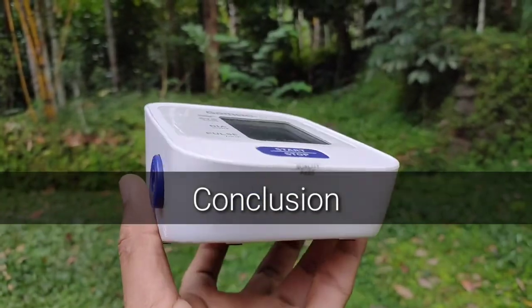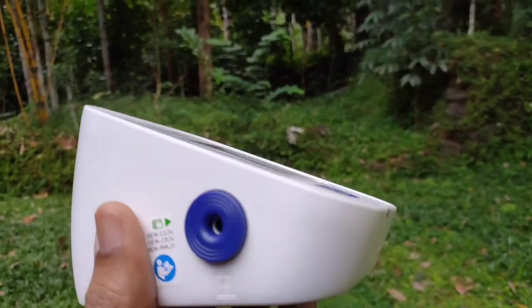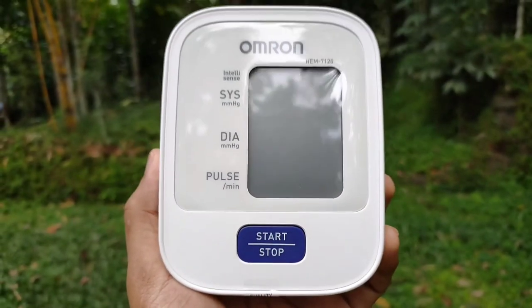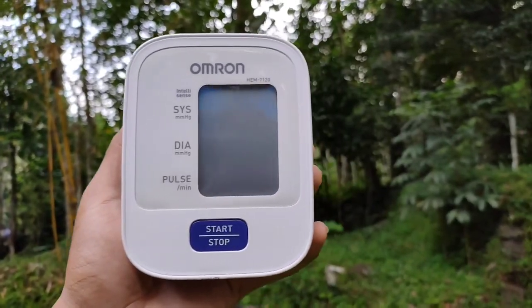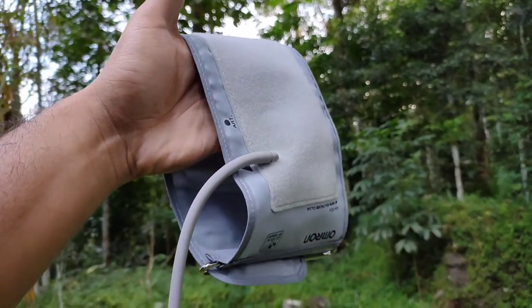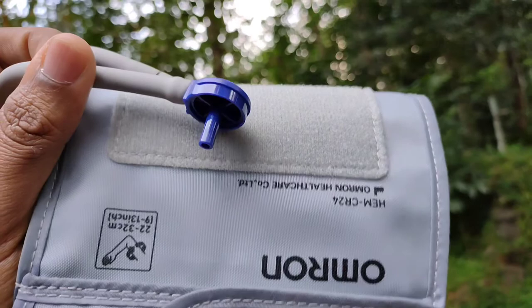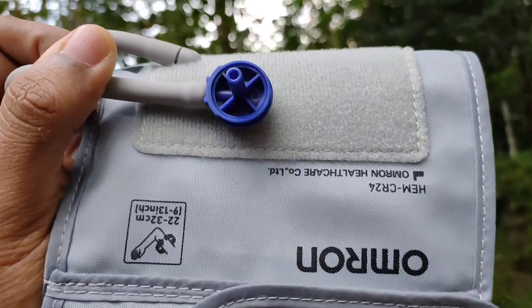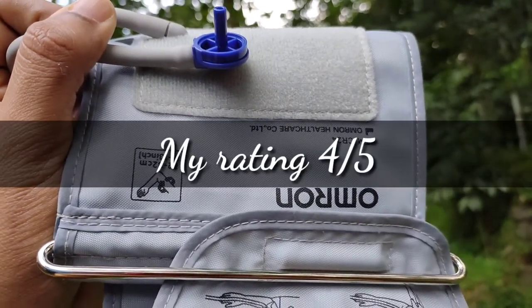I bought this blood pressure monitor for my parents and it was priced at Rs 1800. It's definitely a good product in this price segment and the values are more reliable than any smartwatch in the same price range. Build quality and construction are really good, though I felt it would have been great if Omron had provided a carry case or pouch. The arm cuff is of latex-free construction, made of nylon, polyester, and PVC — it feels good and the texture is just right. One concern: when I ordered from Amazon, 5 years of warranty was mentioned in the product description, but now they have changed it to 3 years, so I do doubt the after-sales service. Based on my user experience, my rating for this product is 4 out of 5.